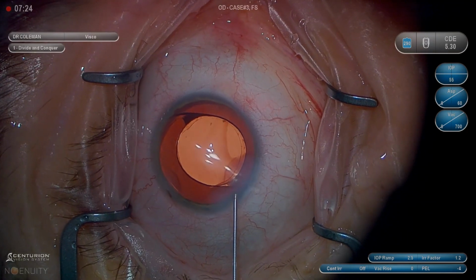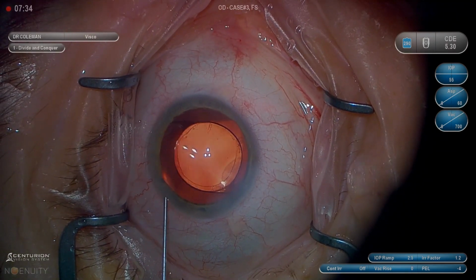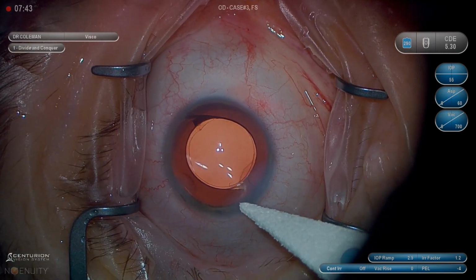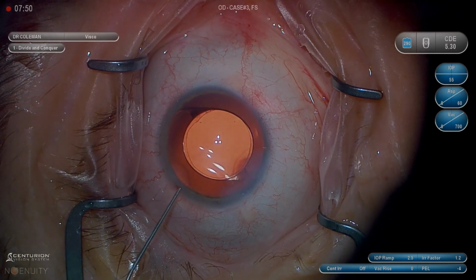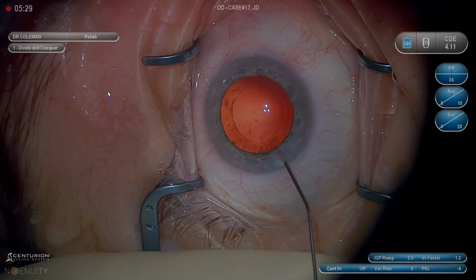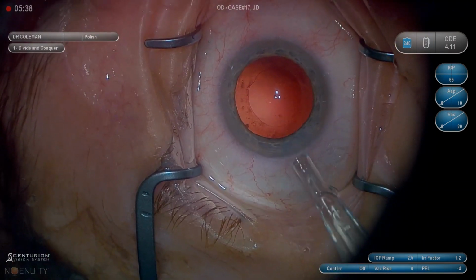So, you know, the key to getting a wound that seals well is to have a well-constructed wound to start with. We all know that. If you have a long wound, if you have a short wound, they can torture you the whole case for different reasons. So every step builds on the previous step, and trying to get consistency surrounding those steps is critical. That's the reason that I made these videos. So if you're struggling with one step, and you'll notice through your career that you'll have something perfected, and then one day your paracentesis wounds are leaking and you have no idea why. Hopefully you can go back and watch this video and maybe help identify the problem. That's happened to me several times where I hit a mental block, and you know, nothing's perfect, and you get better over time, and consistency gets better, and at some point you don't have those problems anymore.